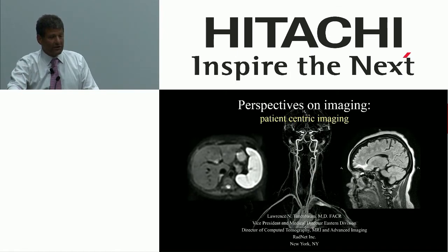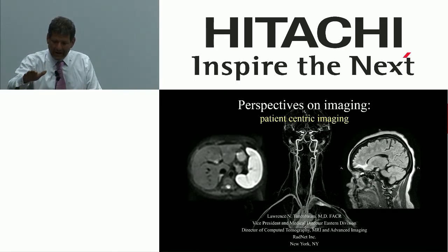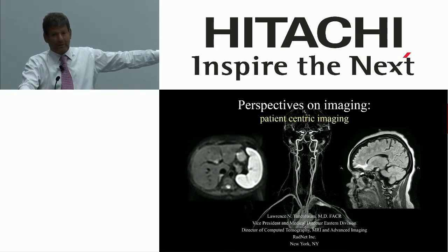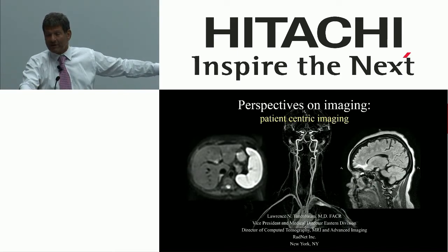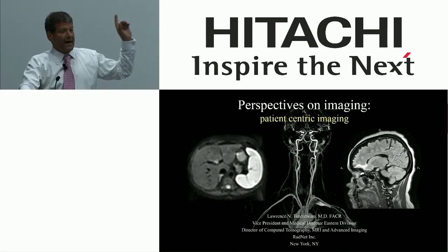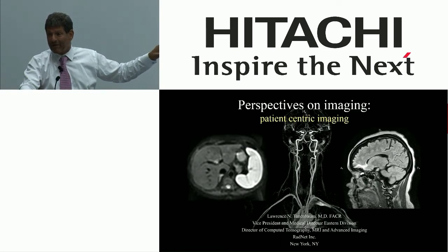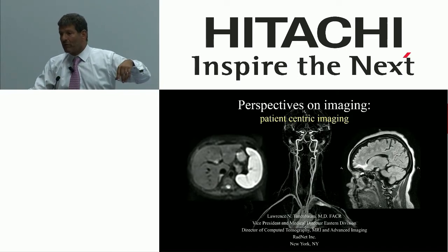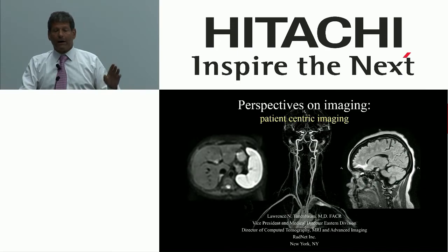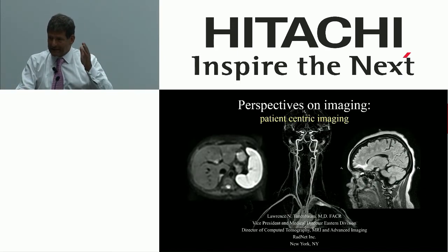I use noise reduction algorithms on every magnet I run, from 3T through 1.5 through 1.2. Noise reduction algorithms are an essential tool. Okay, just like I'm not going to give my patient double the radiation to avoid using iterative reconstruction, I am not going to give my patient double the scan time and an uncomfortable patient experience and a loss of diagnostic information that I can't provide now because I'm scanning twice as long without noise reduction. I believe in noise reduction. The algorithms are spectacular on modern scanners, and I think they're essential.